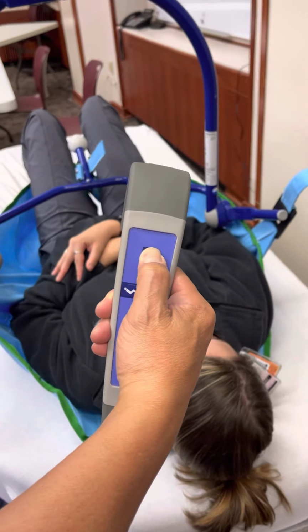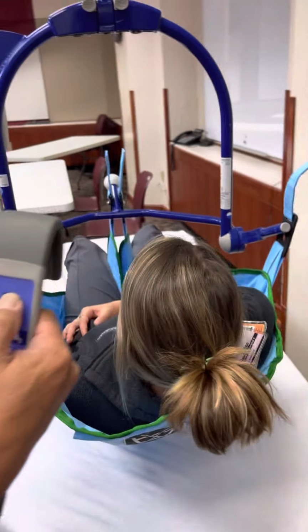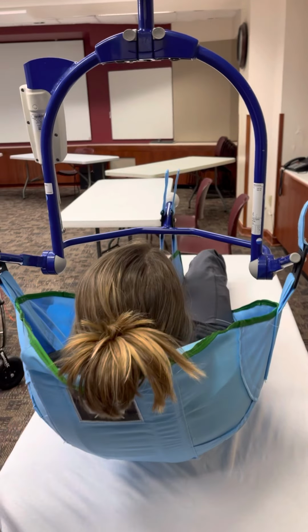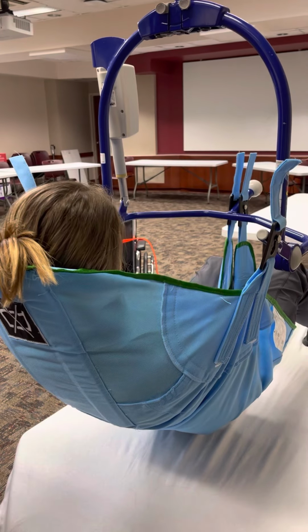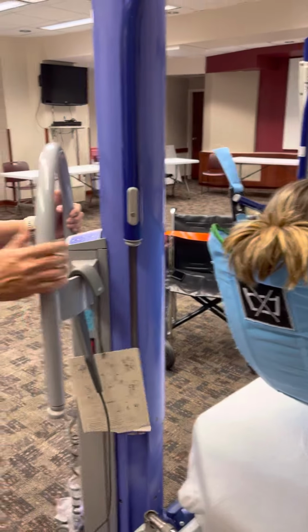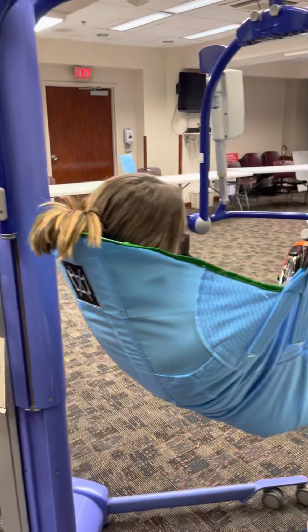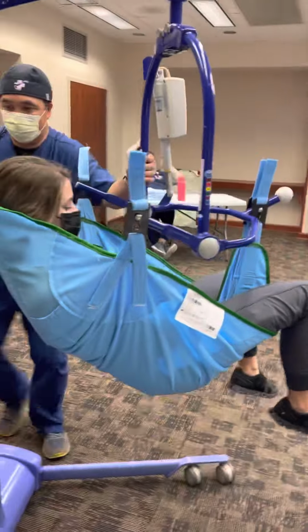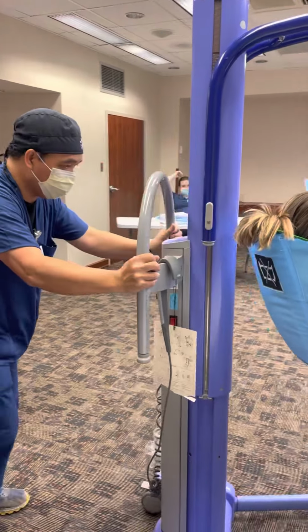So the patient is lifted off the bed. And the patient will just kind of slide in and settle down. So just make sure the head is supported right there. Go up some more. Now when the bottom clears the bed, then you can move the lift away from the bed. Position it right here, and you can move the lift towards the chair.